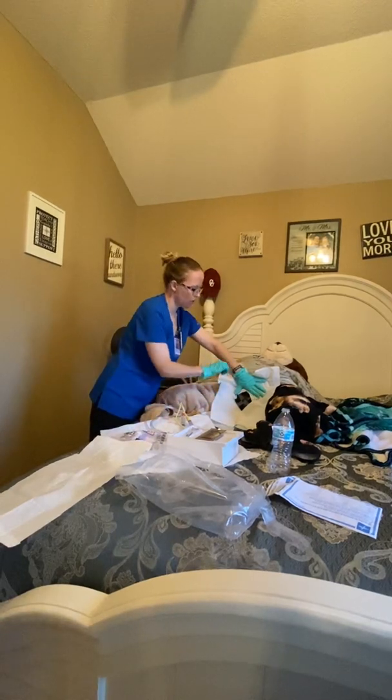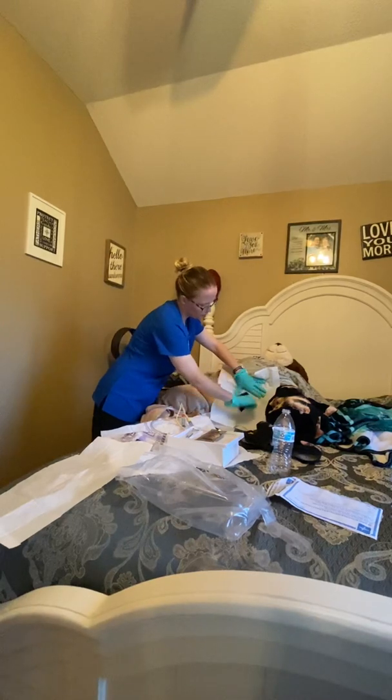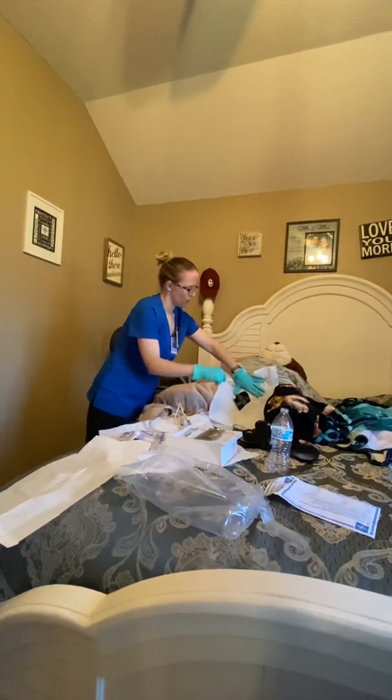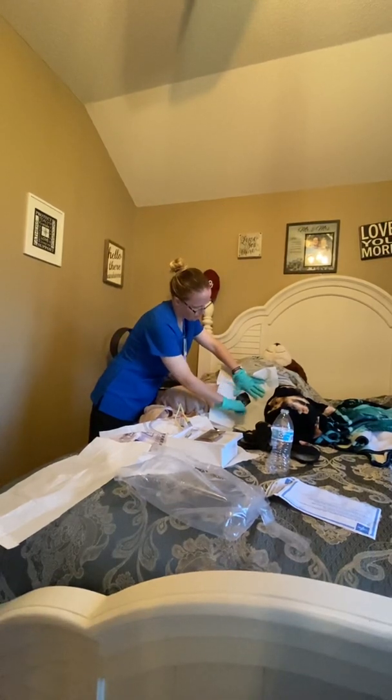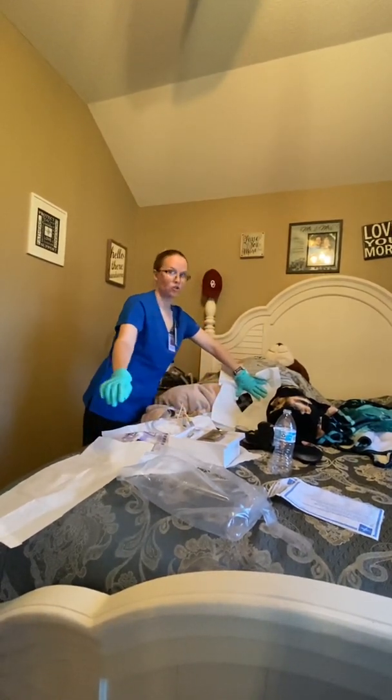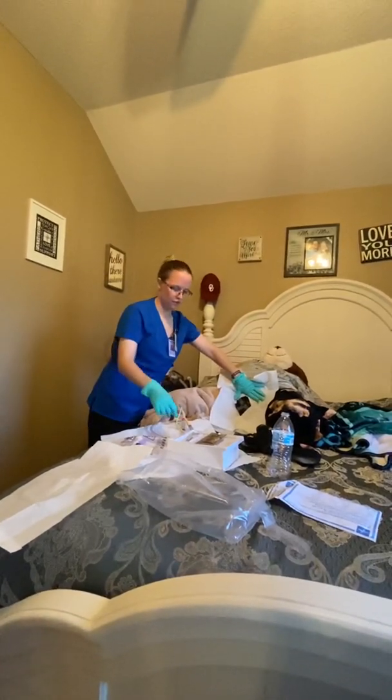You're going to get the second one. You're going to clean from the clitoris on the side furthest away from you down to the rectum, and then discard it. And then you're going to get your last one, and you're going to clean from the middle, top, all the way down to the rectum. That's your cleansing. Now, we're going to insert the catheter.